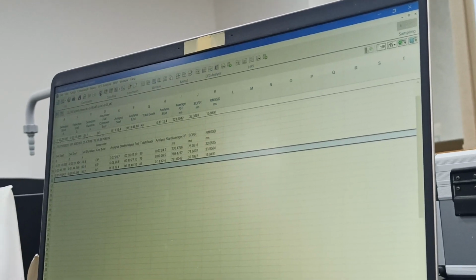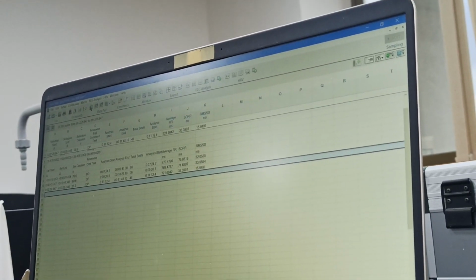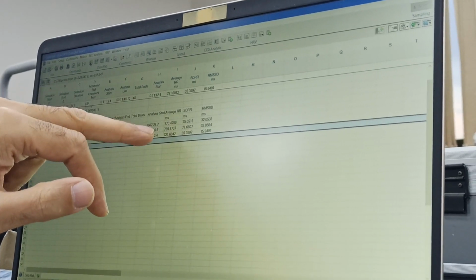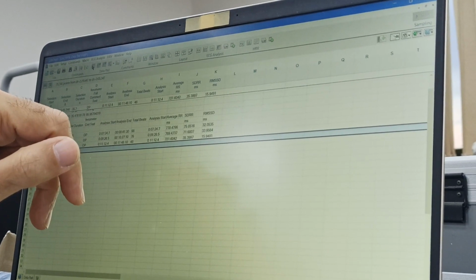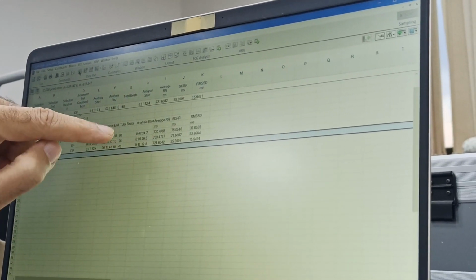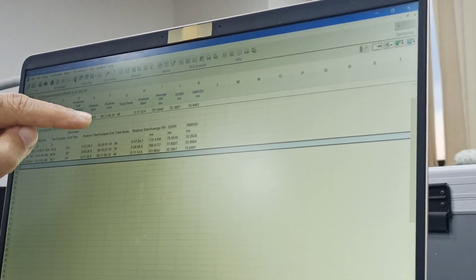So the demonstration is very clear. We are just looking at these two things. Average RR was 770, 769, and here the average RR is 721. The other important thing, if you see, the total beats are only 48. So I have not selected a large area, equivalent to what was selected before. This is my mistake. I should use an equivalent area to make a comparison.